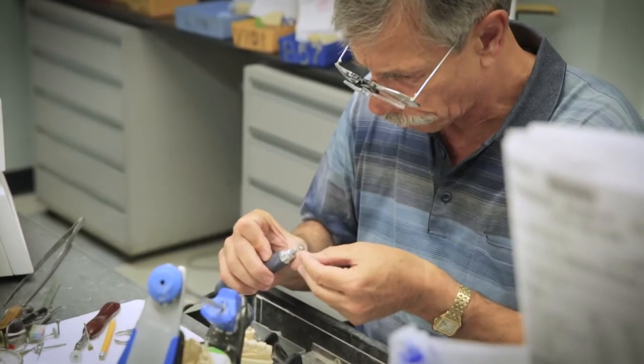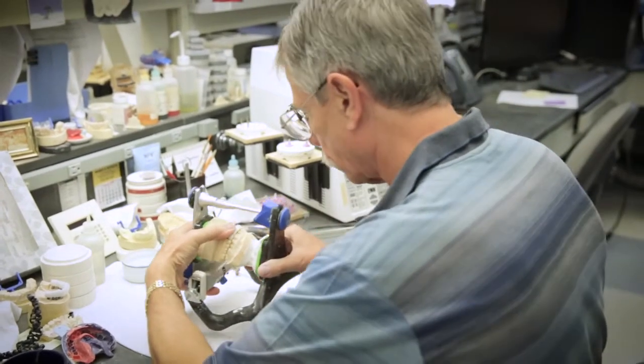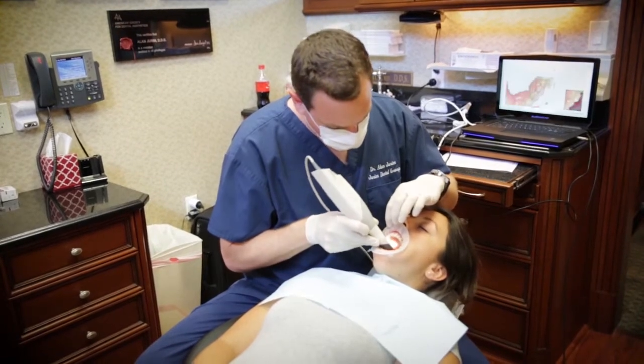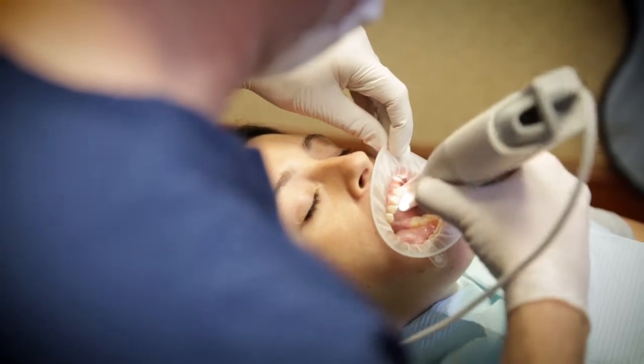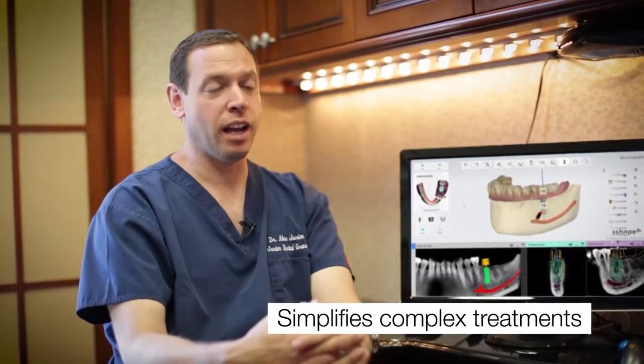I would say that the way that we used to work with our implants and plan our implants was much more of an analog style workflow, which really meant that when we were ready to get to the final phases, we would keep our fingers crossed hoping that we had the ideal scenario for the restoration, which wasn't always the case. The way that Trios and Implant Studio fulfill our implant needs is by taking what can be a very complex workflow and complex system and making it simple.